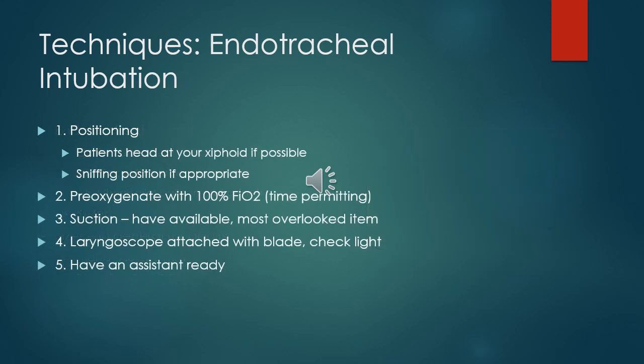The next few slides are going to run through actually intubating. I'm going to skip through most of this and only hit highlights. One of the most important things is that whenever possible, try to maximize the ergonomics to set you up for success. Obviously, in emergency situations, this may not be possible, especially outside of the operating room, but try to raise the patient to an appropriate height so that you're not having to stoop. Additionally, make sure that you're able to pre-oxygenate for as long as possible. Again, in emergency situations, this is usually less than an ideal amount of time.